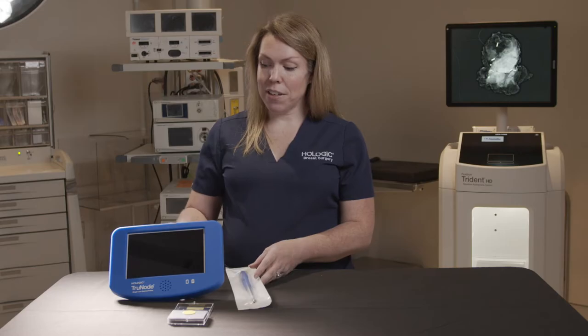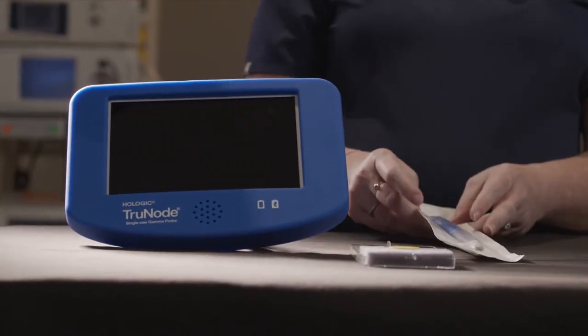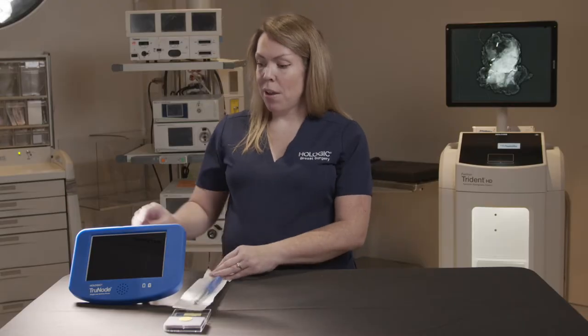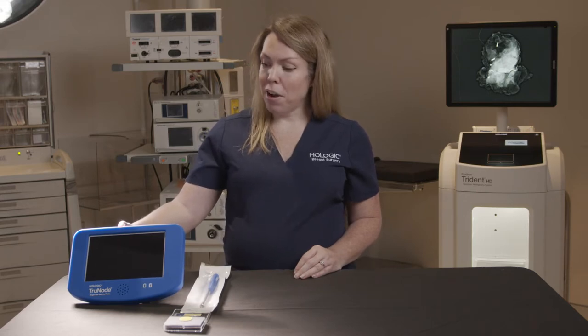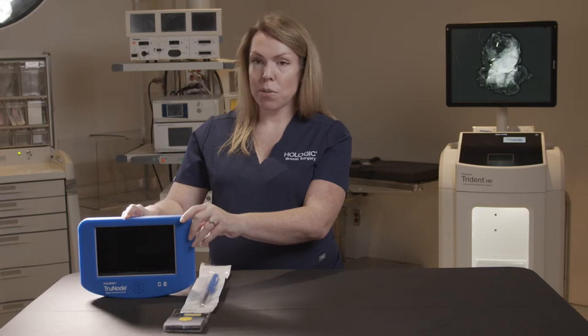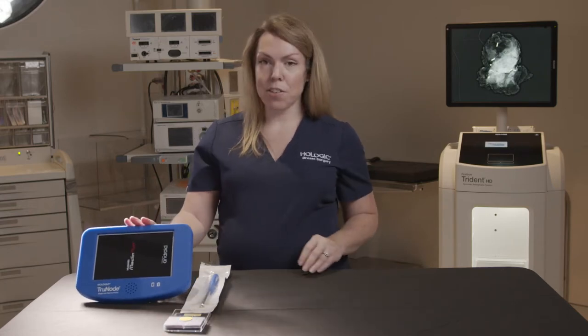The system itself consists of a user feedback unit tablet and a single-use sterile probe. We're going to go ahead and turn the UFU, or user feedback unit, on. The power button is right on the top of the device, so we're just going to hold that in and you'll see the screen starting to illuminate.